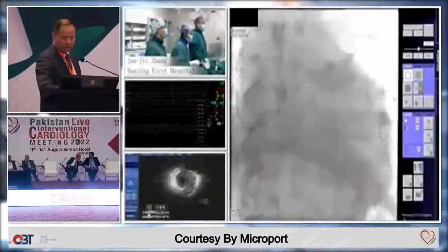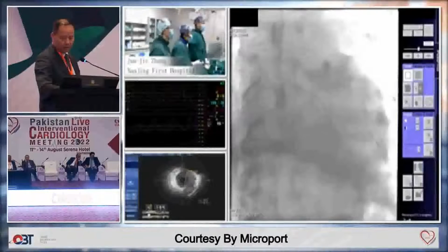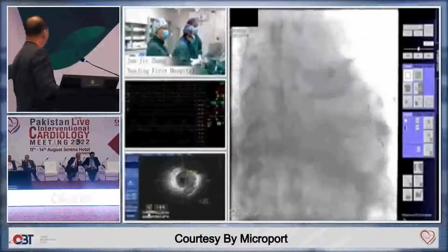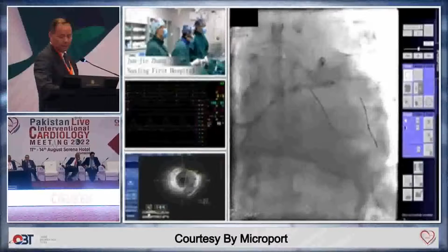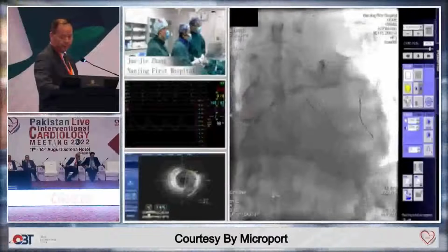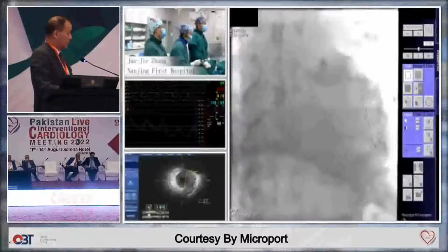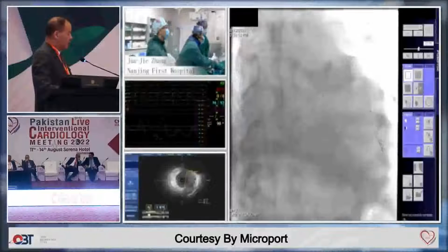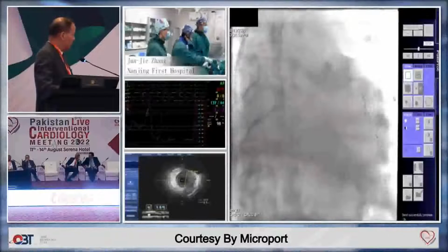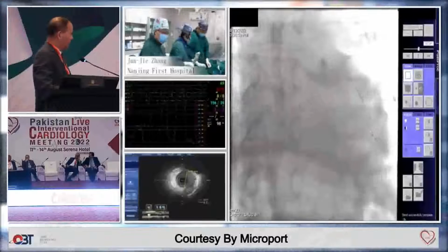Okay, so you have deployed the stent. Yeah. I pull out the stent balloon a little to do the post dilation, and also the side branch optimization with a higher pressure up to 12. So this is a stent balloon. Yes. Recently, we have slightly modified the DK crush. For the side branch optimization, we can use a stent balloon or another NC balloon, to try to minimize the gap between stent and the wall.